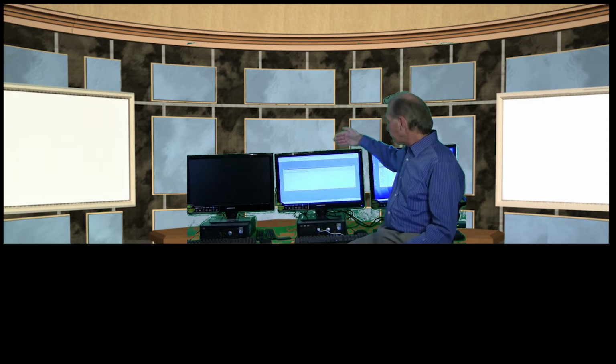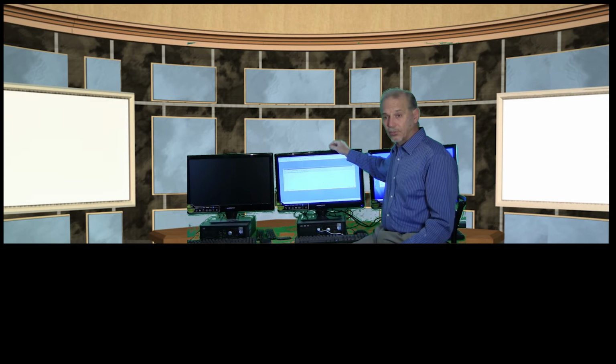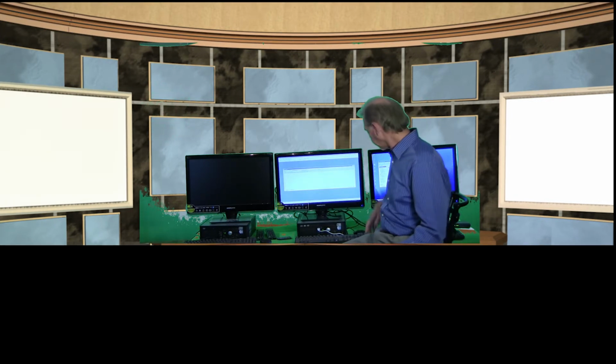And then there's the 24-inch TV monitor. This works as your computer monitor as well as a television, so you can both do your computer work and entertain the patients when you're not showing them their images. It's a full 1920 by 1080.